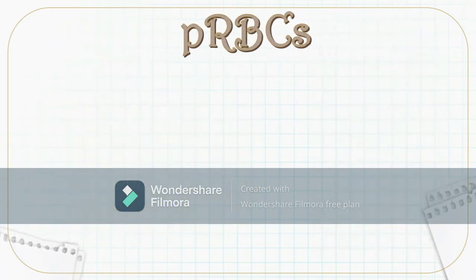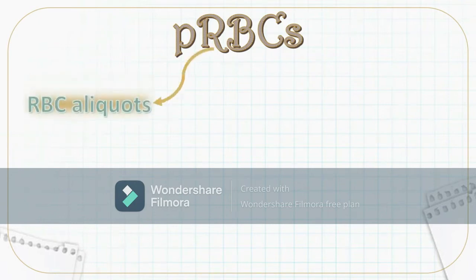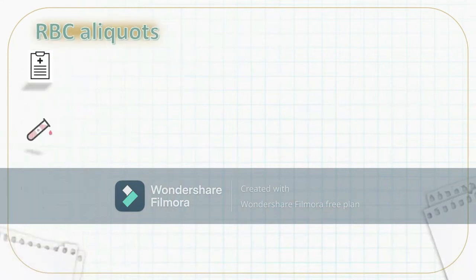Additional specifications for packed red blood cell unit preparation may be required depending on who the recipient is. These specifications should also be met to avoid the occurrence of adverse transfusion reactions. Because of this, packed RBCs can be further prepared as the following. It could be prepared as RBC aliquots, leuko-reduced red blood cell units, washed red blood cells, and frozen red blood cells. First, let's have our RBC aliquots.